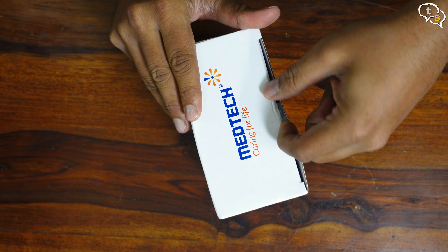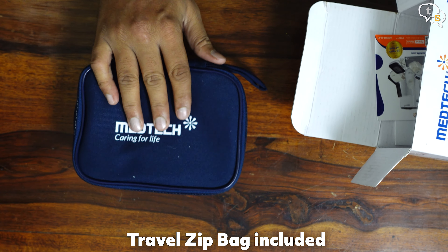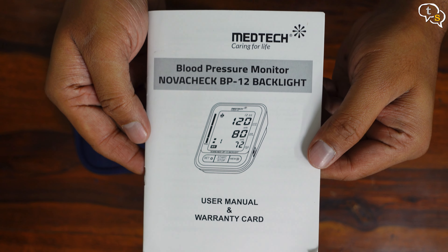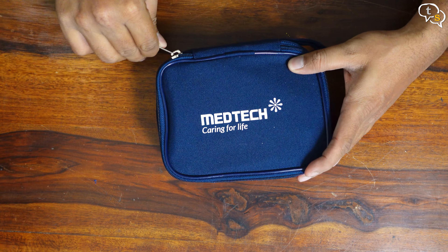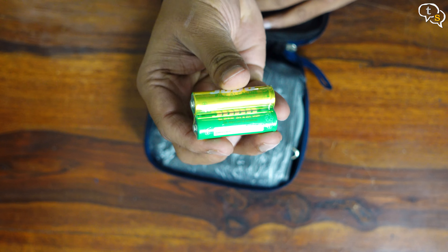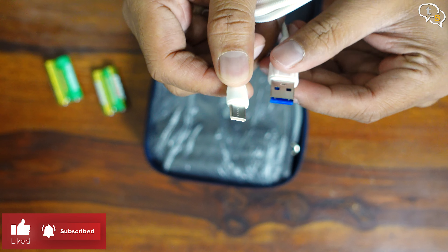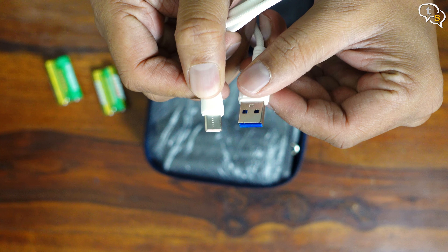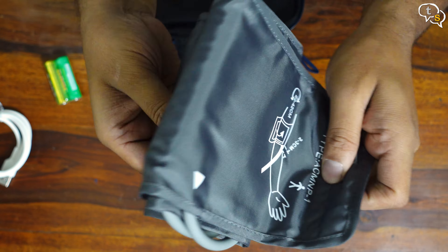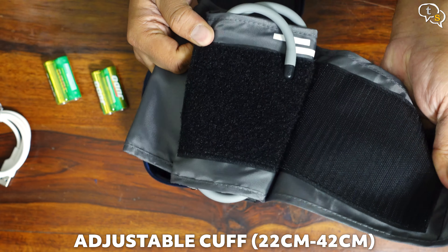Let's open up the box and check out the actual device. First off, we have the zip bag, which also has the BP monitor within. A product catalogue is available, along with a user's manual which is also the warranty card. Back to the zip bag — we have 4 batteries included. There's also a USB-C cable; I'll try later if we can power the BP monitor via this cable, so we can use a power bank instead of spending on batteries. And here's the cuff, which opens up like this — similar to how all BP machine cuffs work.